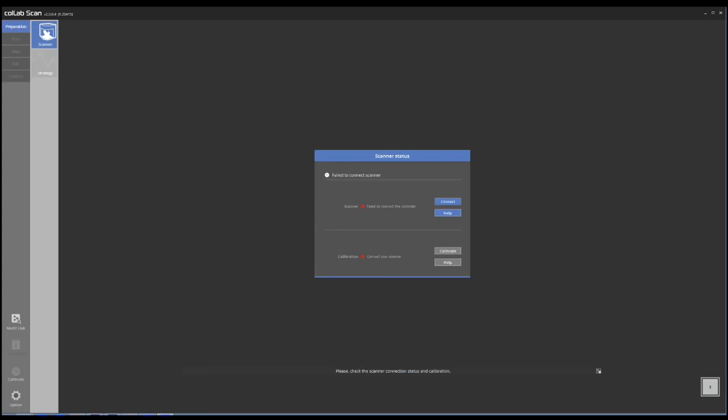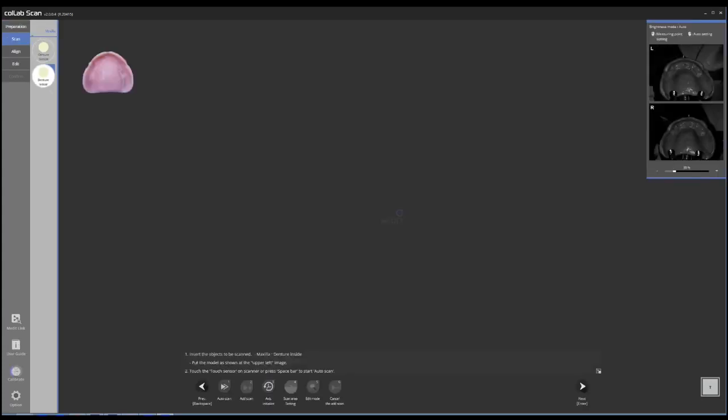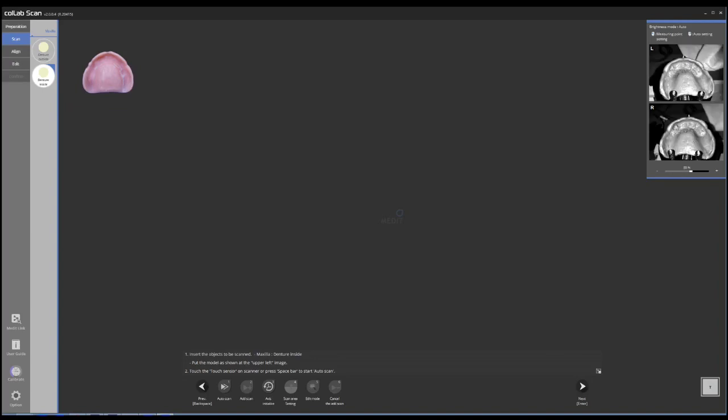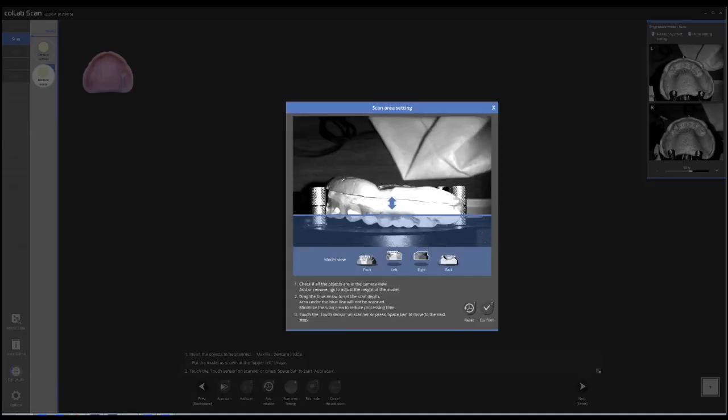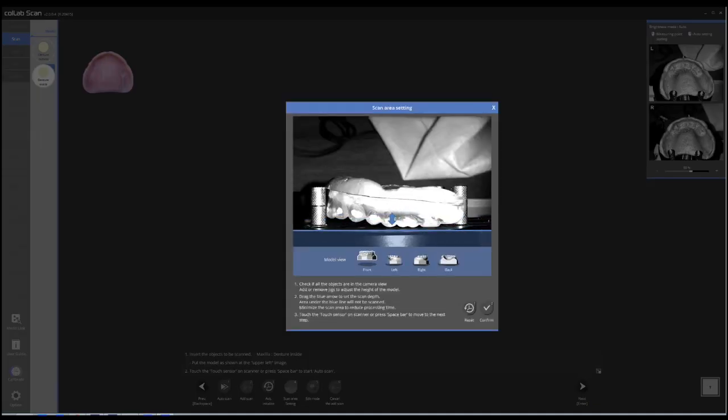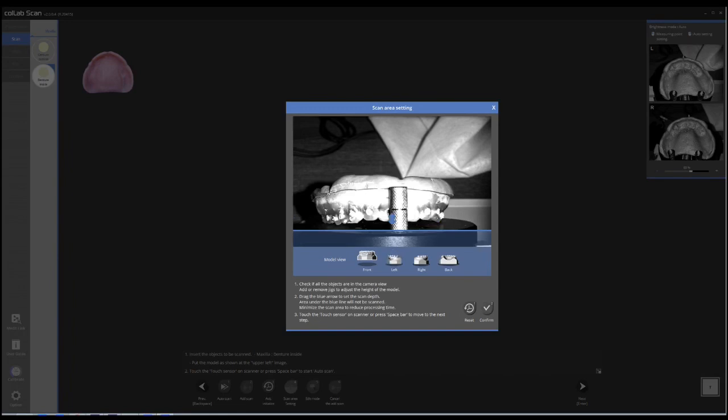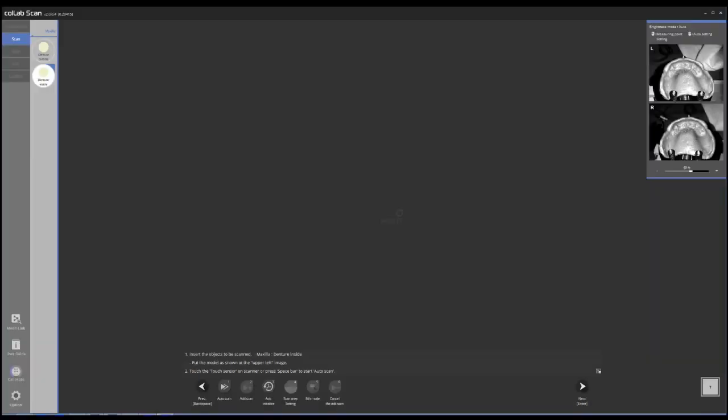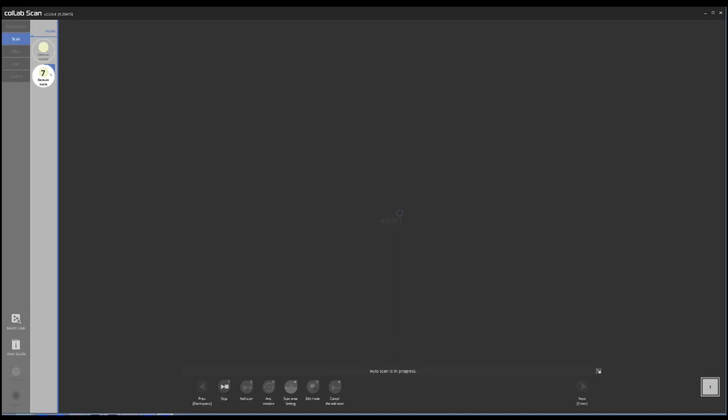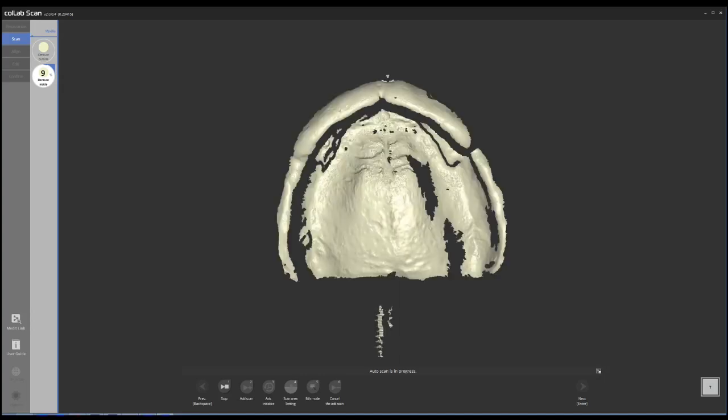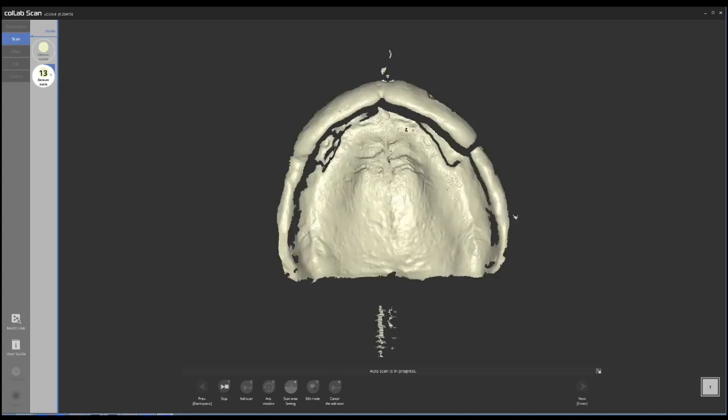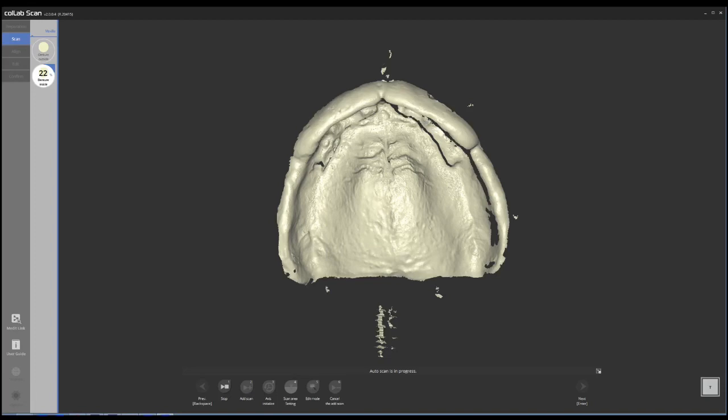There are going to be two parts: the outside and the inside. In this case, I'm going to start with the inside. Just crop the area that you want to scan, then the software with one click is going to scan everything. You just put the denture in there.